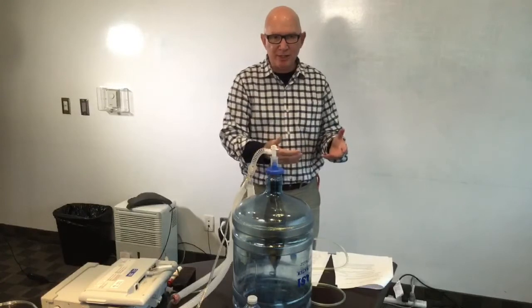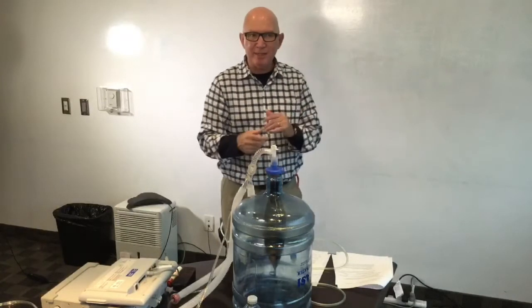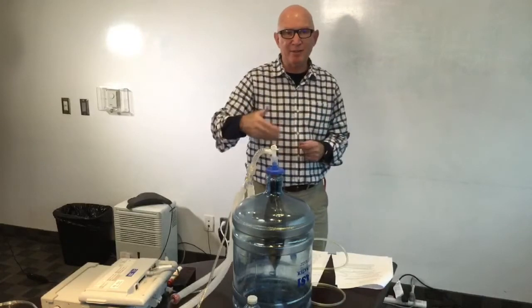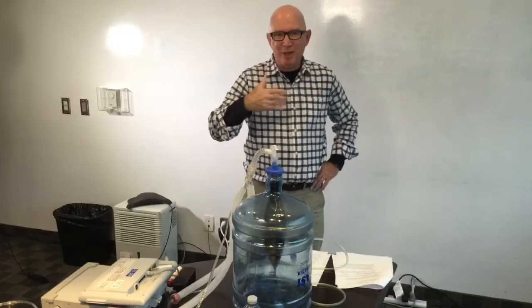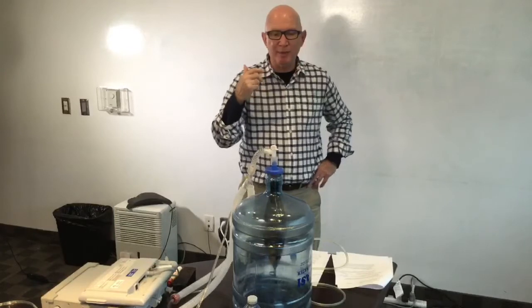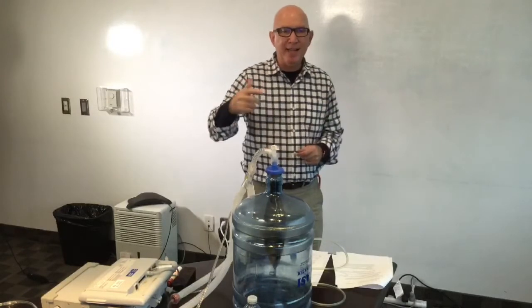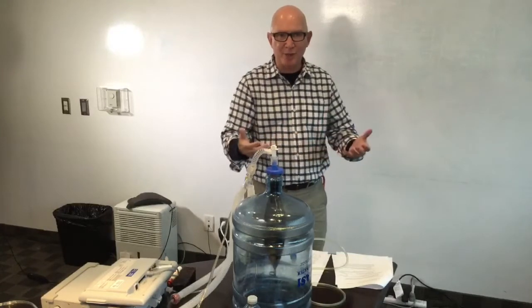Again, some of the research that's gone into the interaction between the diaphragm and the ventilator demonstrates that even when a patient is well sedated, they will continue to have diaphragm function. So what I mean by that is that they may not visibly appear to us as the operators like the diaphragm is actually being triggered by neural impulses from the brain, but one investigator has discovered that when the lungs start to expand with a mechanical breath, that in itself can trigger the diaphragm to also have some electrical activity and contract.